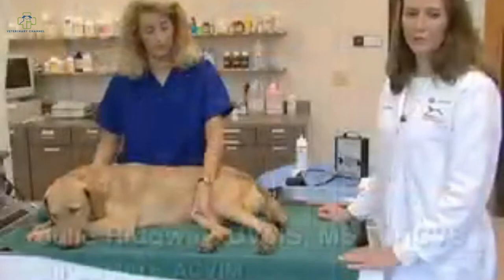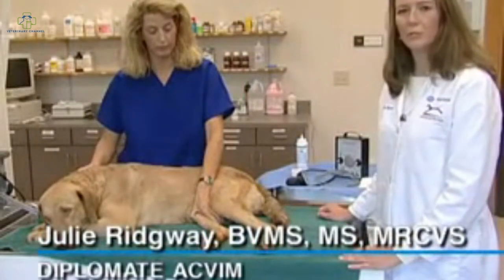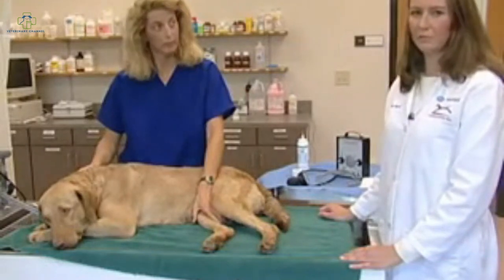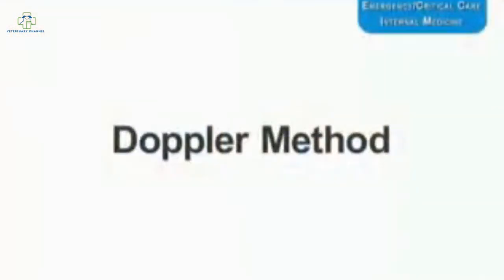Blood pressure measurement is a very important part of small animal practice. There are numerous indications for its use and a number of different methods available to measure it. The method we're going to demonstrate today is the Doppler method.